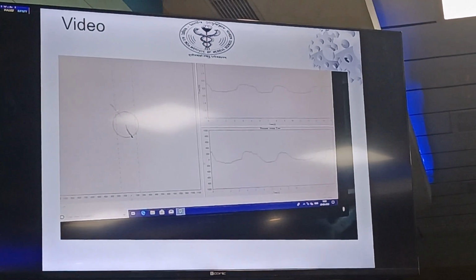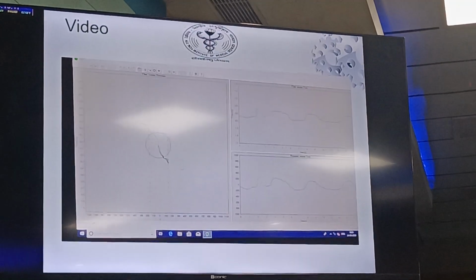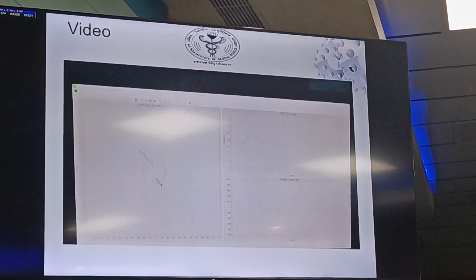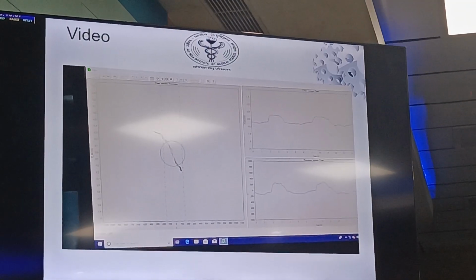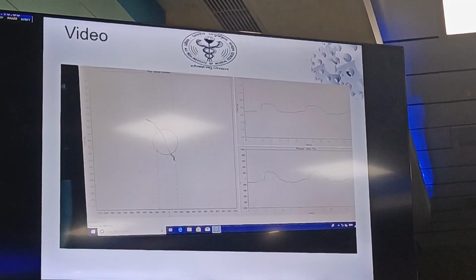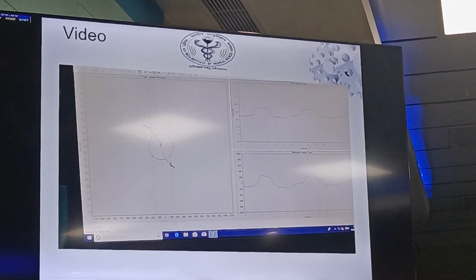The graph which is showing over here is of the right nasal cavity. The graph should ideally be falling between these two lines if the nasal resistance of the patient is good. The graph that we use for clinical measurement is the flow versus pressure graph. The flow is on the y-axis and the pressure is measured on the x-axis.